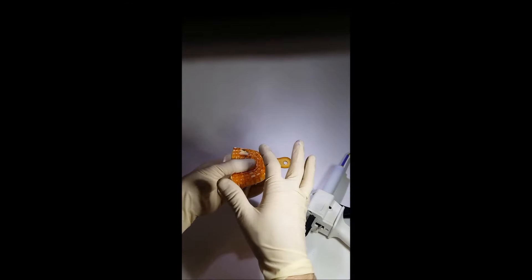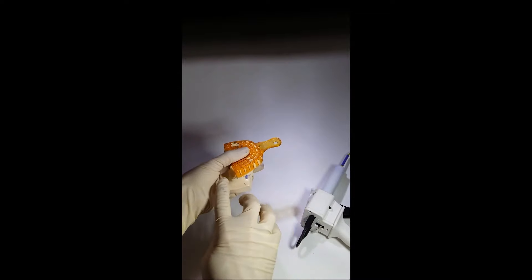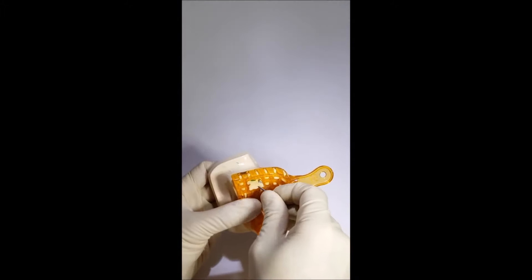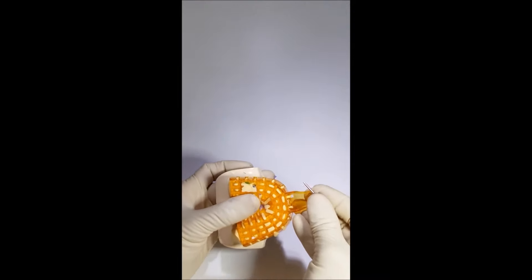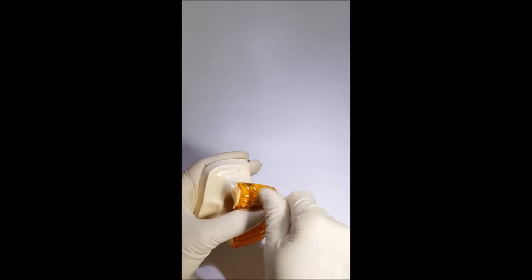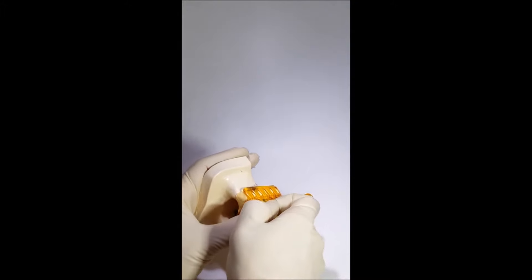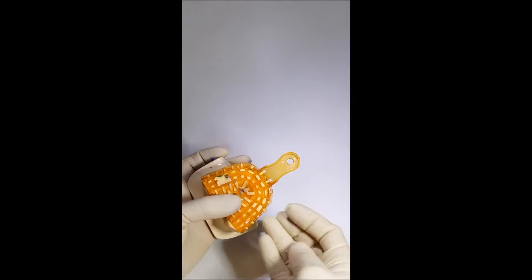Let's wait until the material is hardened completely. The impression paste is now fully hardened. In order to remove the impression tray with the open tray technique, we have to unscrew the screw from the transfer that penetrates through the tray. Closed tray transfers are not screwed through the tray. Now we sharply remove the paste from the patient's jaw.